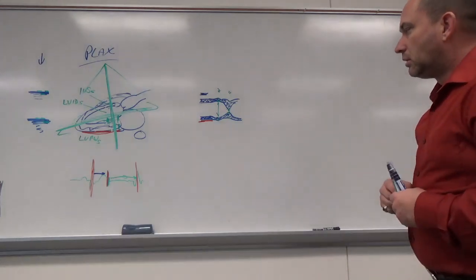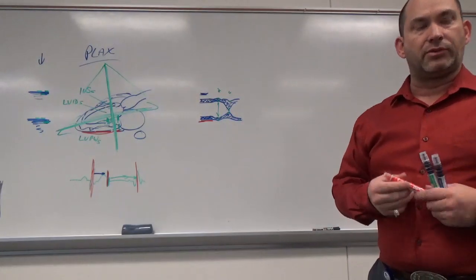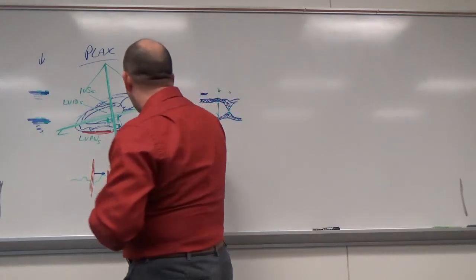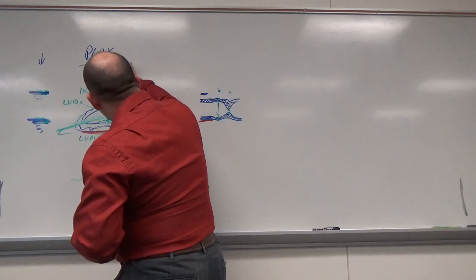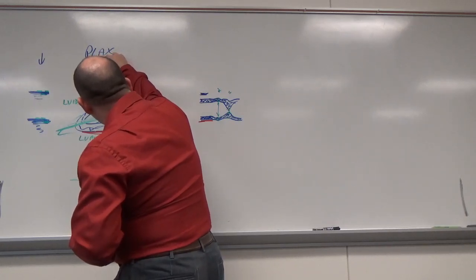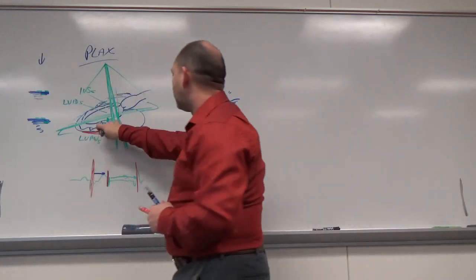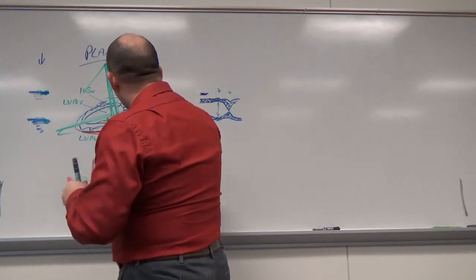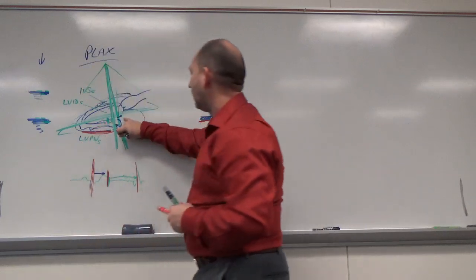Good. So let's move from there up to the mitral valve. There's one other M mode that we take. We do not do this in 2D, we only do this in M mode. We want to be perpendicular and hitting both mitral valve leaflets at the same time, the anterior leaflet and posterior leaflet. So that line is coming right through here, through the tips of the leaflets. I'll redraw those leaflets. So I want to see that and go through that.